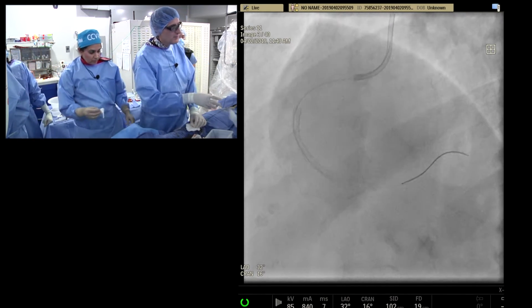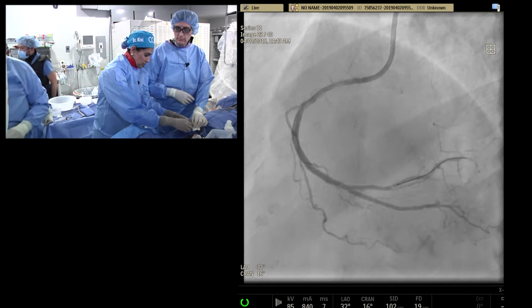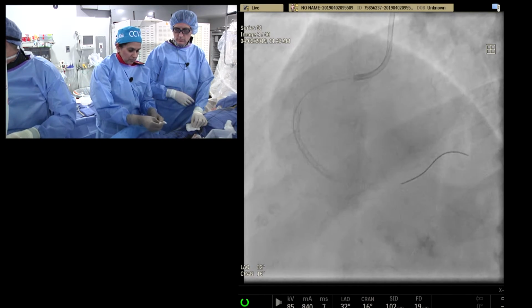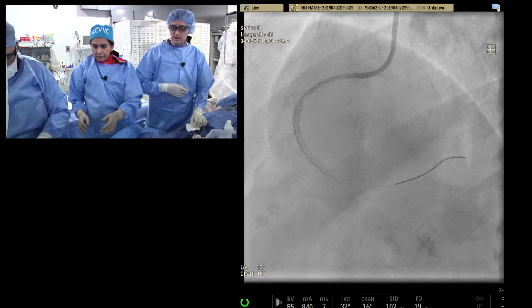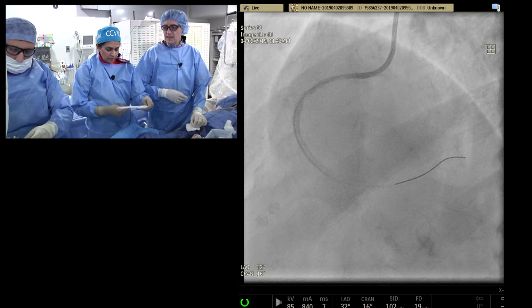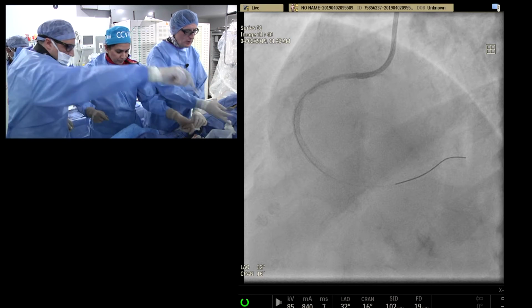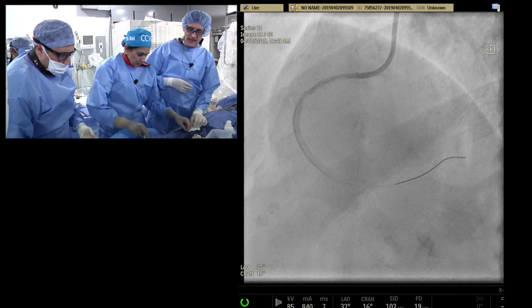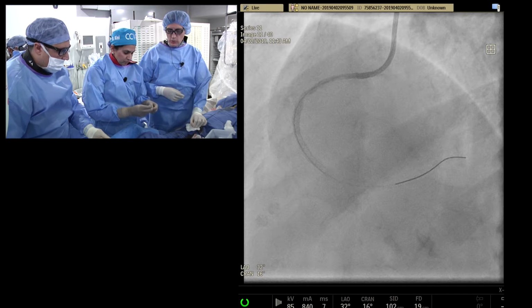And we know that in order to prevent the stent from thrombosis, dual antiplatelet therapies work best, better than oral anticoagulants. And in a patient like this, it's good that the patient is tested, sensitive to clopidogrel, so this way we can plan better from now on what to do. Perhaps we can discuss a little bit this plan as we put in the second stent in. Yeah, it's great. You can carry on this discussion with the experts.